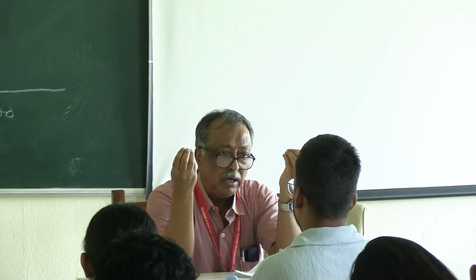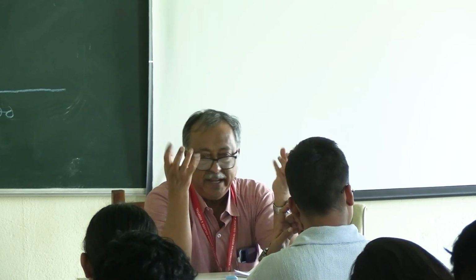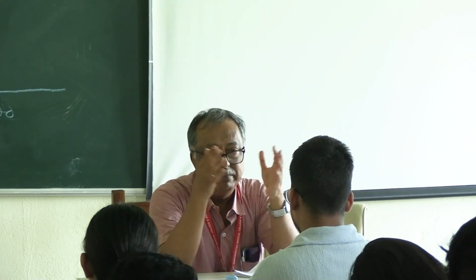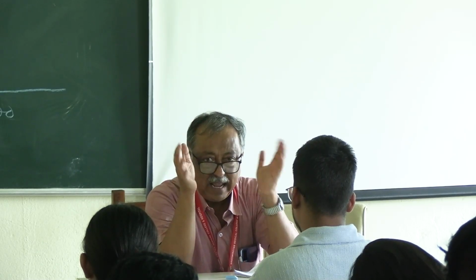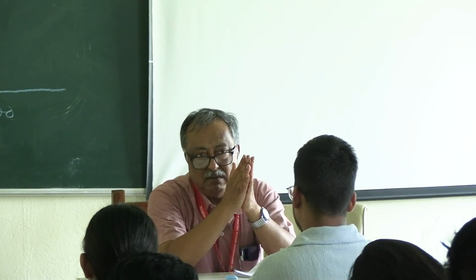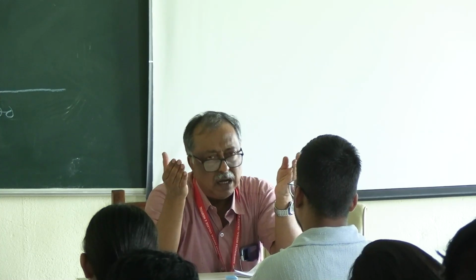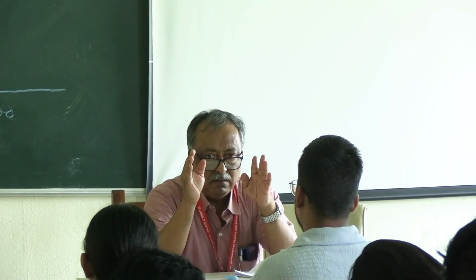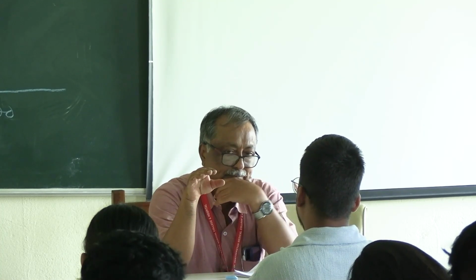When testing a hearing aid by computer, an audiometrician doing the trial for the hearing aid, the loudness discomfort level is very important. Sometimes it is seen that some deaf persons feel discomfort in a range, suppose 70 to 120 decibel. Then you try to avoid this level of intensity.